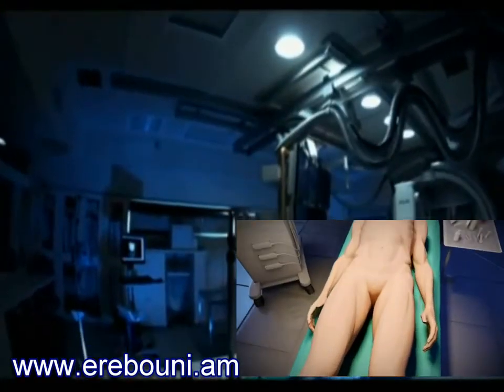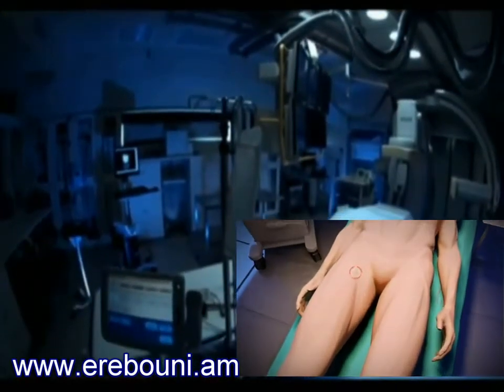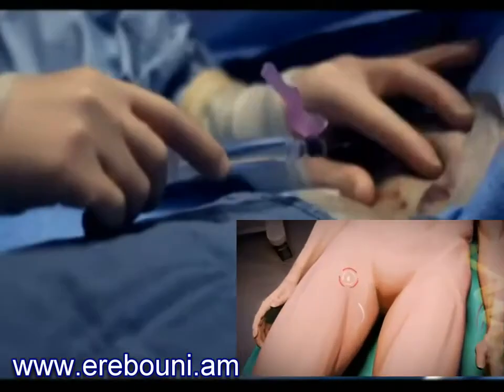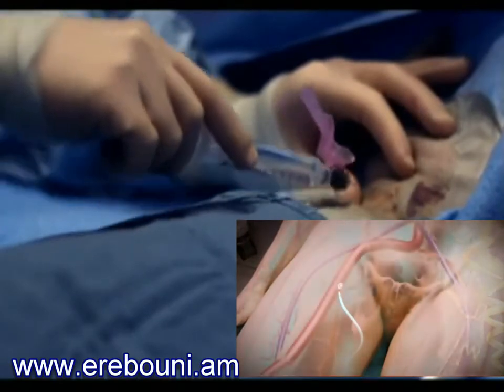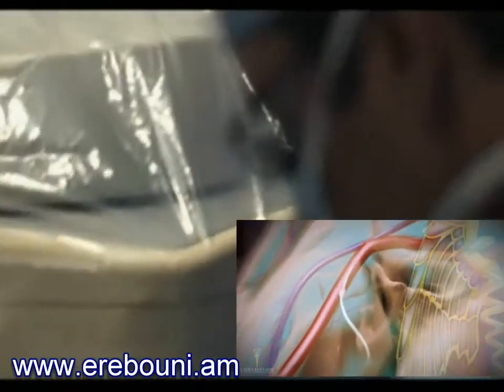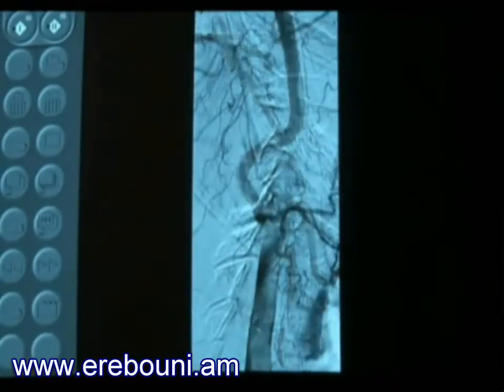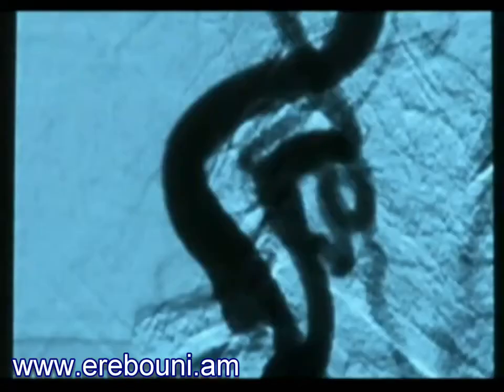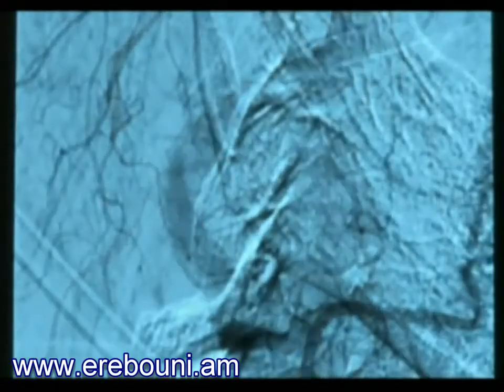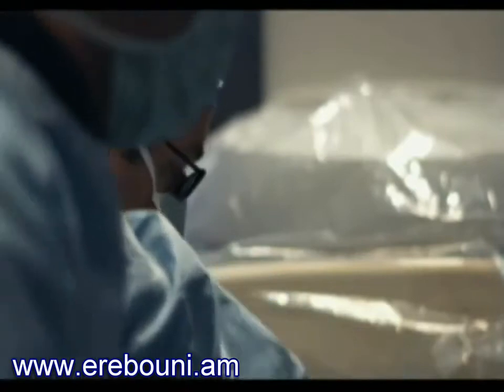The procedure takes place in the cath lab. The patient is awake and alert. A local anesthetic is applied to numb the catheter insertion area. Then the narrow areas of the arteries are located by injecting dye and reviewing live x-rays called fluoroscopy. The dye does not allow x-rays to pass through, so the physician is able to clearly see arteries and uses the live x-rays to guide them to the blockage.